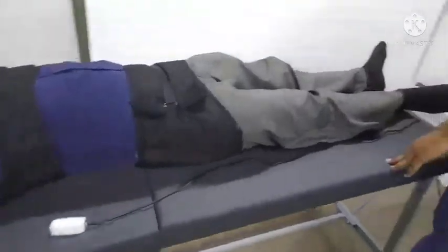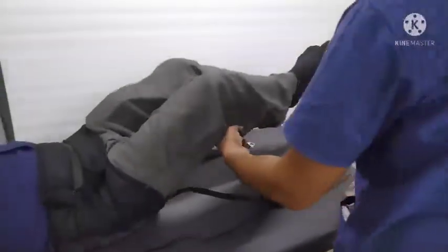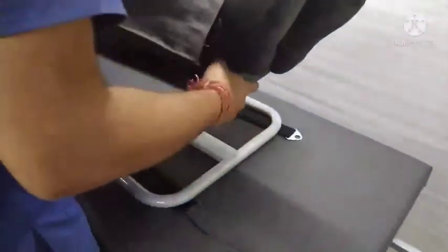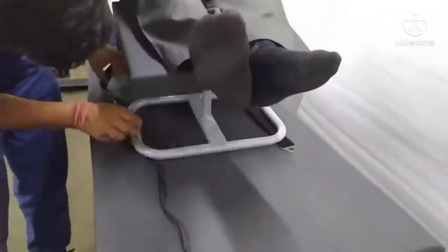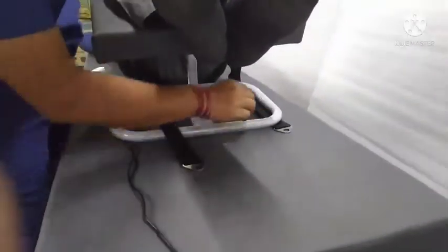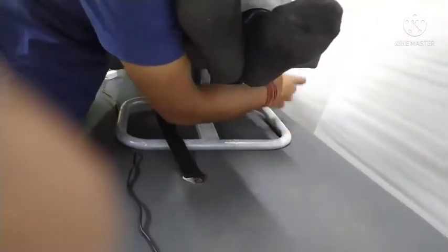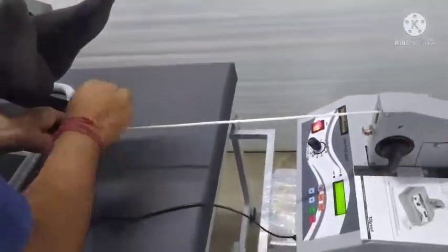Now we connect the hook to the lumbar belt.